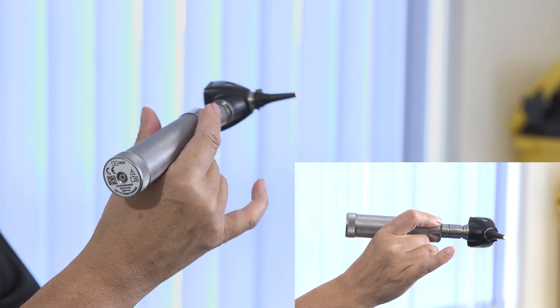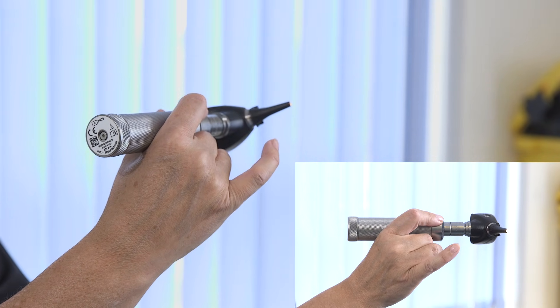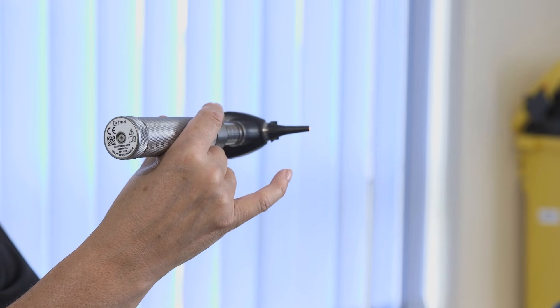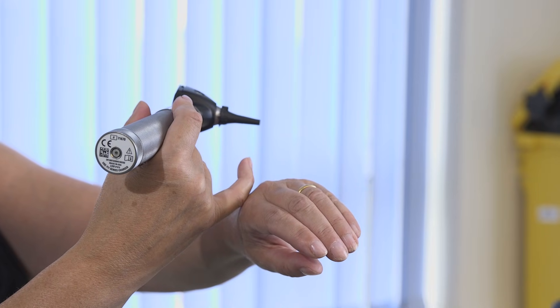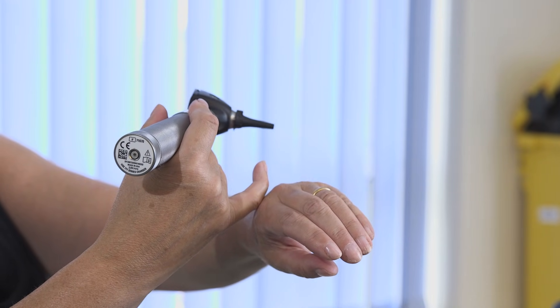When you use the otoscope you don't want to be holding it like a hammer or a dagger, but instead hold it like a pen. You can see that I protrude my little finger, and the idea is that it will rest on the patient's zygoma, giving you a nice platform so that, particularly in children, if they move you move with them.